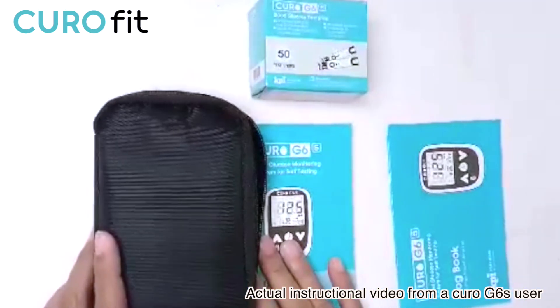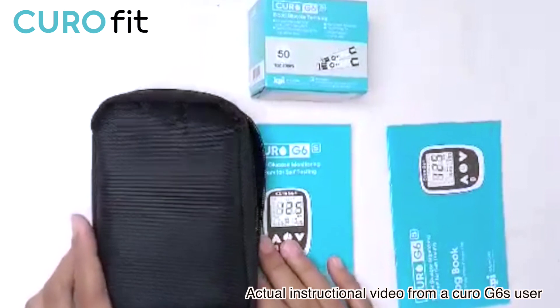In this video, I'm going to show you how to check your blood glucose level. So let's get started.